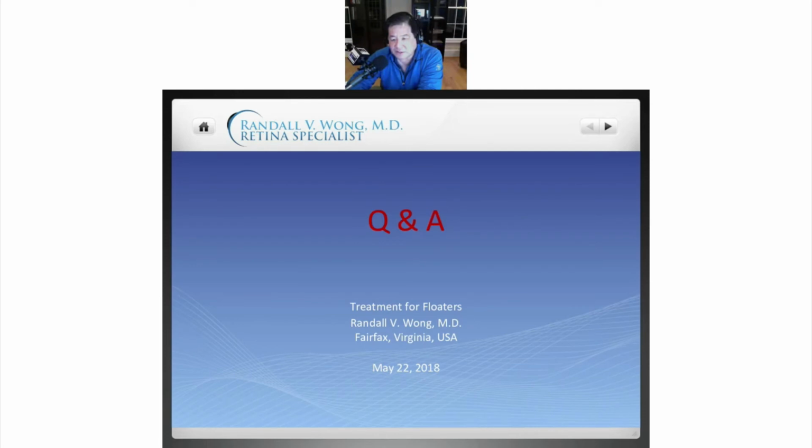Josh says, I realize the vitrectors never pull on the retina, but when inducing PVD, I had to pull, and that tissue is extremely sensitive, that of wet tissue paper. How does that not tear immediately? That's a really good question. Pulling on the vitreous normally does not tear the retina. The technique in which we try to induce a PVD is slightly different than just creating suction when we're doing a vitrectomy.